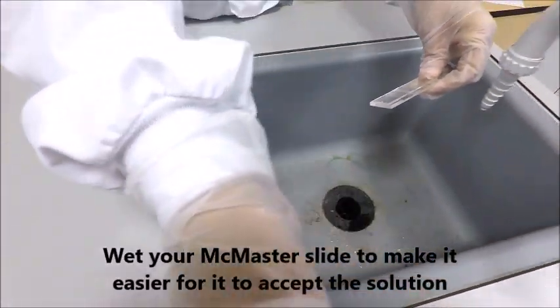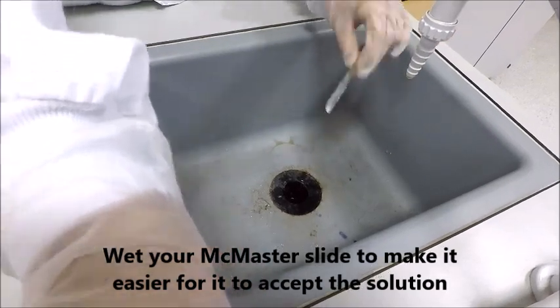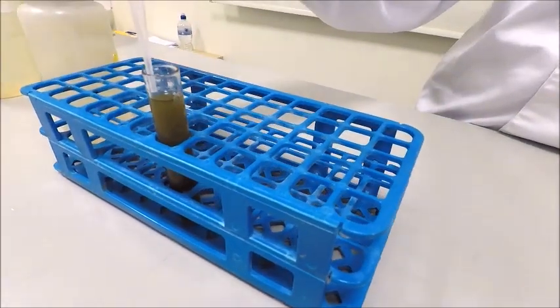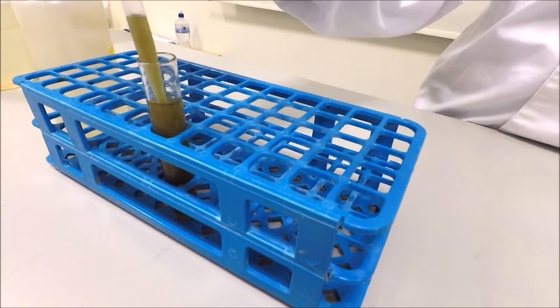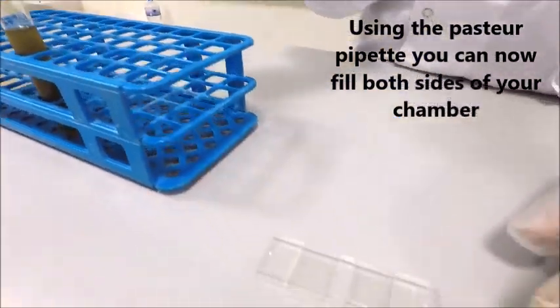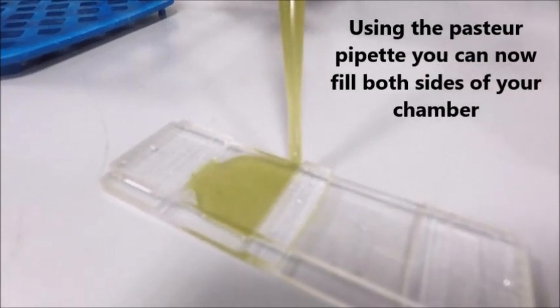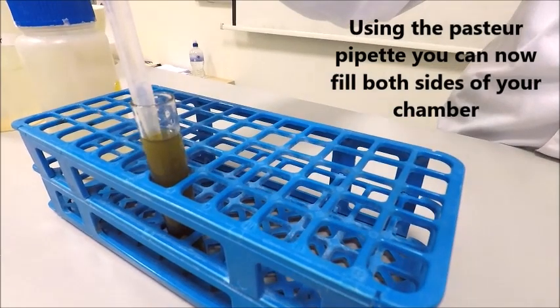Your McMaster chamber can now be filled. Wet it under the tap, as it makes it easier for the solution to be accepted. Immediately after mixing, use a pasteur pipette to fill one side of the McMaster chamber. Return the excess mixture to the tube, remix and fill the second chamber.